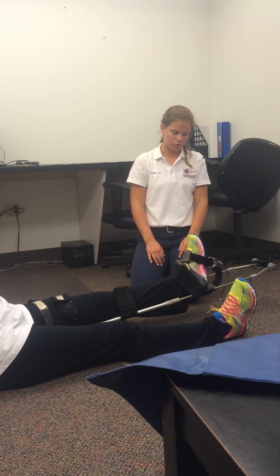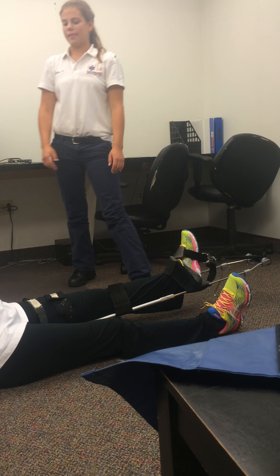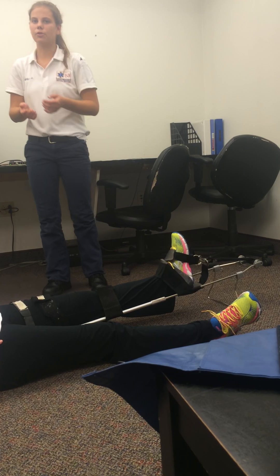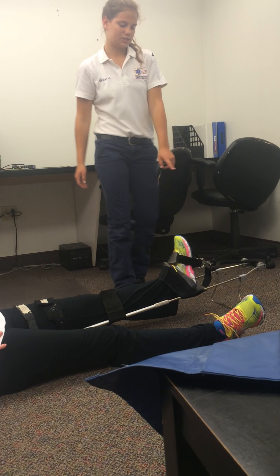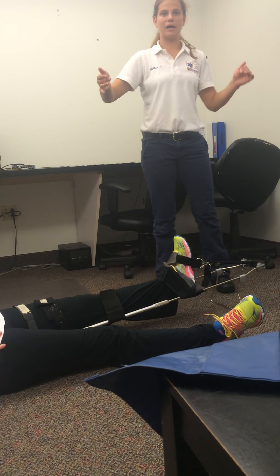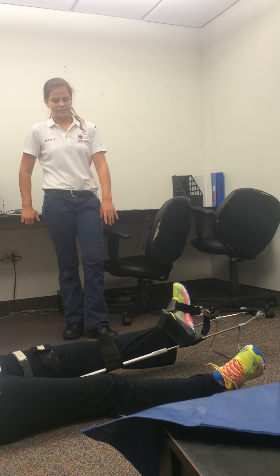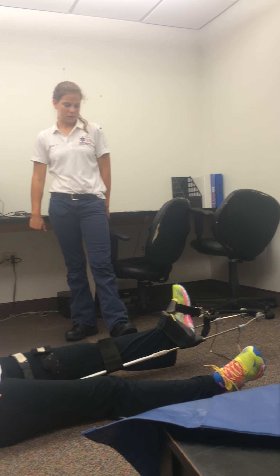When transporting this patient to the ambulance, put them on a long backboard and face them the opposite way they normally sit — so they're looking at the driver. If you put them with their head toward the stretcher end looking out the back, the device is too long and the ambulance doors won't close. Finally, check CSMs after you apply the device to make sure you're not cutting off circulation. And that's basically it.